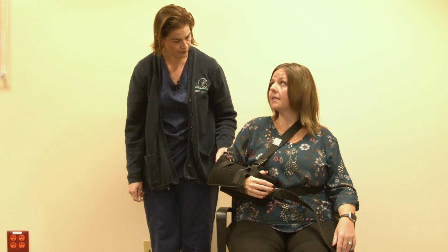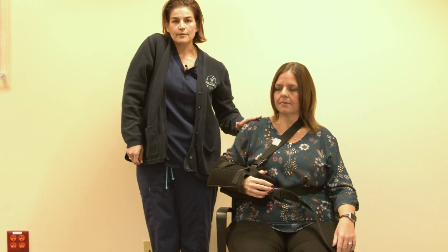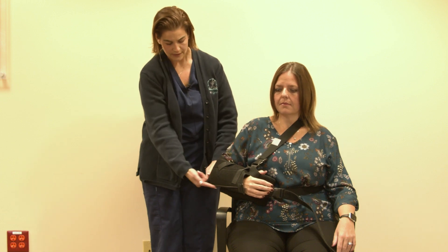Do you feel comfortable? Yes. Her shoulder is relaxed — it's not hiked up towards her ear and her elbow is in the seam.